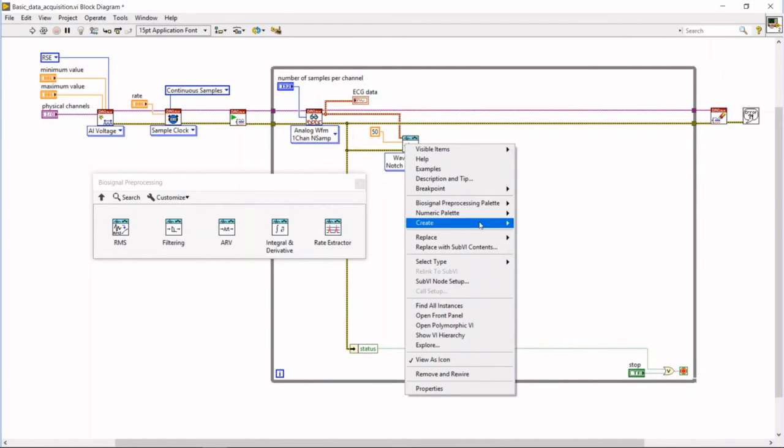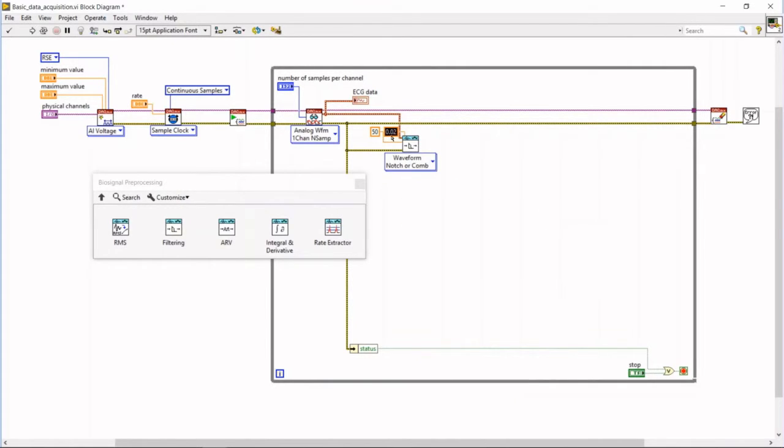So the constant here by default is 0.02, but that is too narrow for our needs, so we're going to put that at 0.2 Hertz. So our filter will not let through frequencies from 49.8 to 50.2 Hertz. As the output, we get our filtered biosignal.